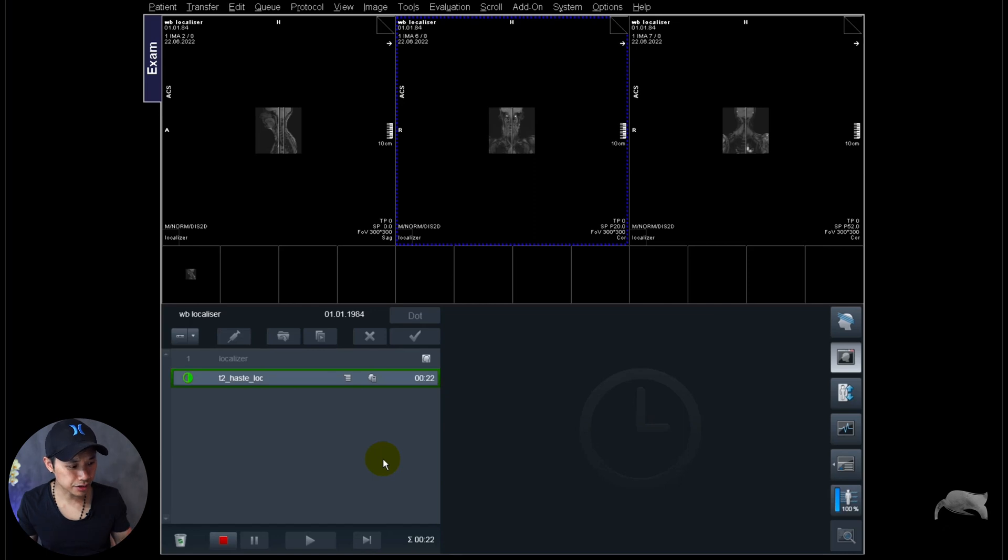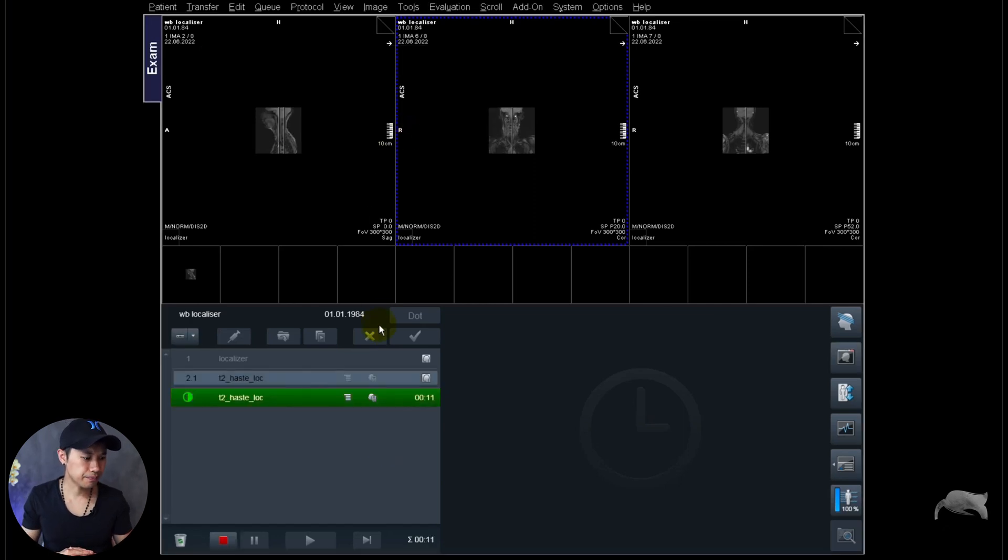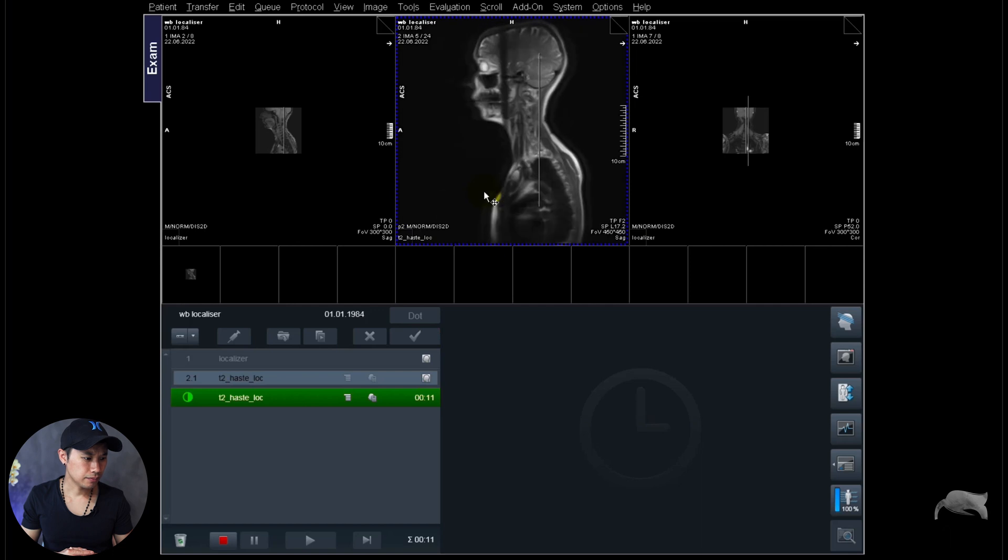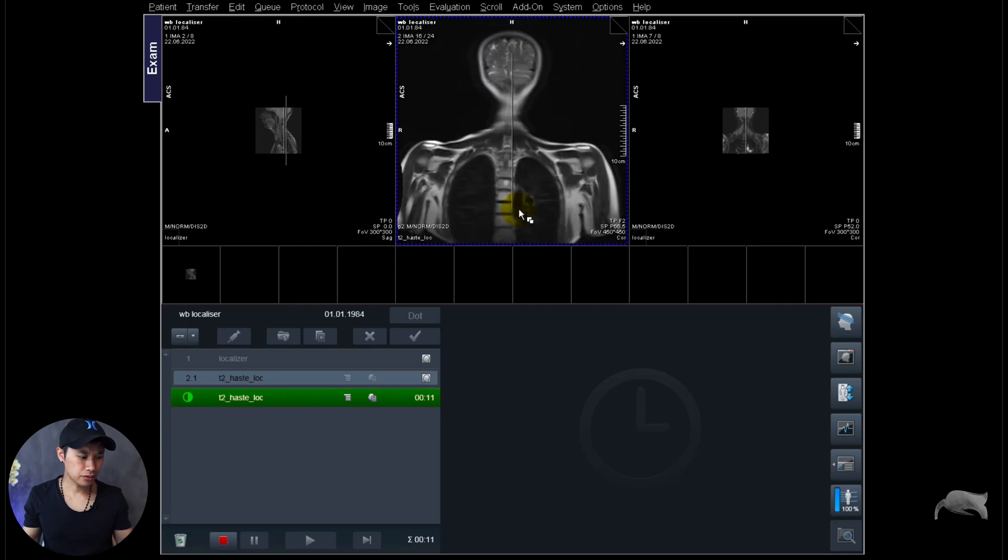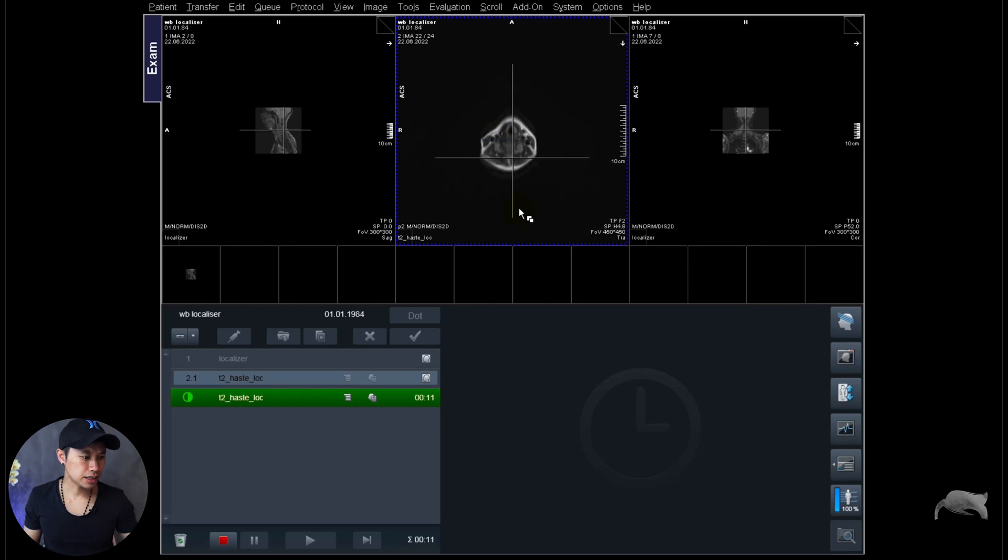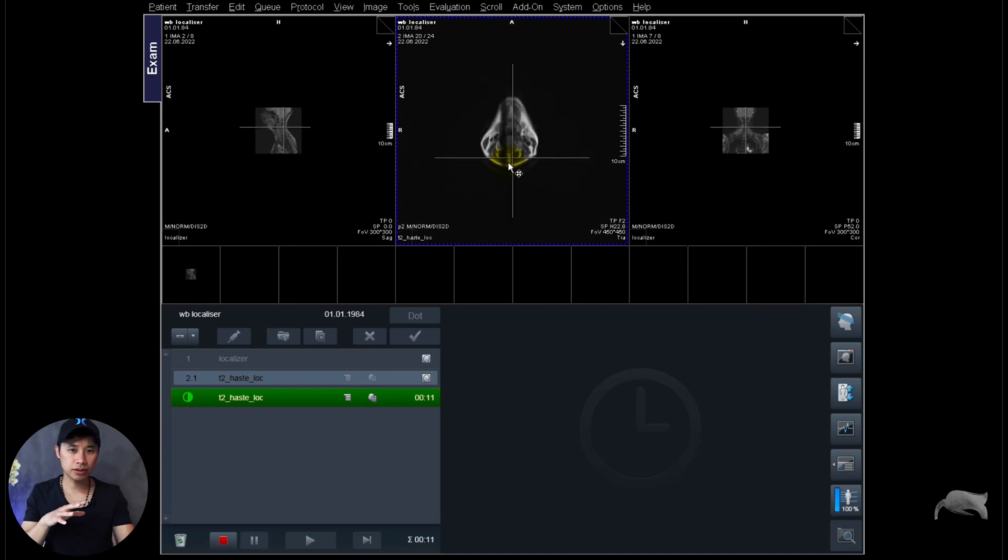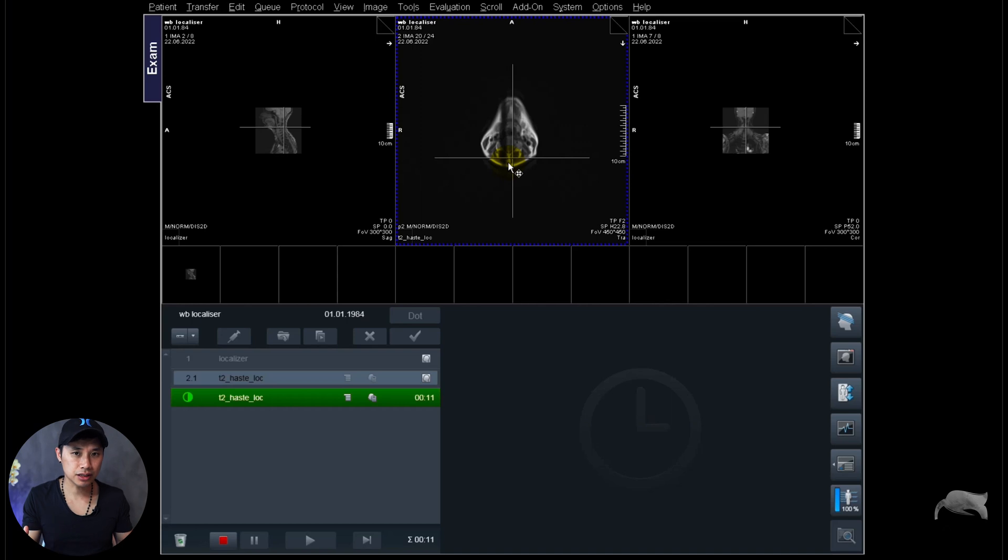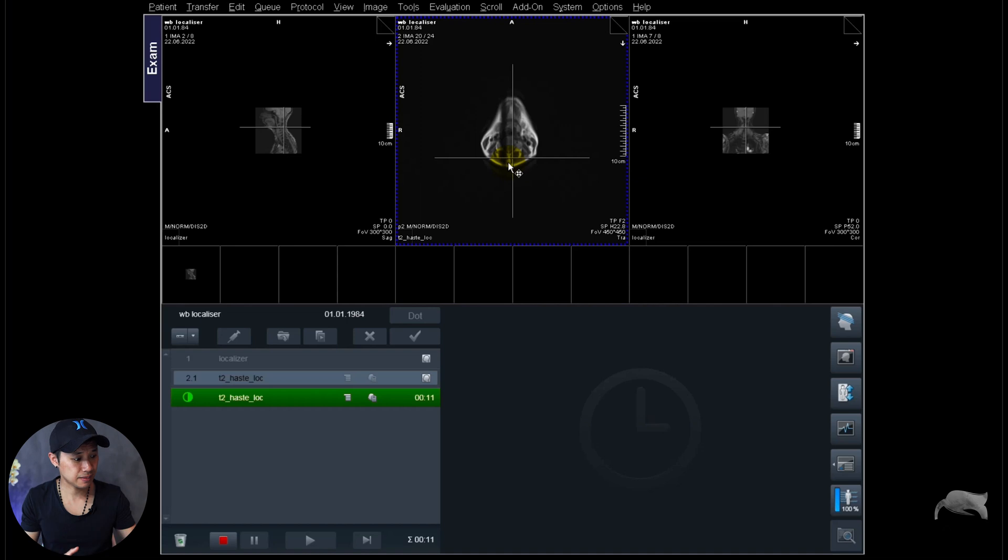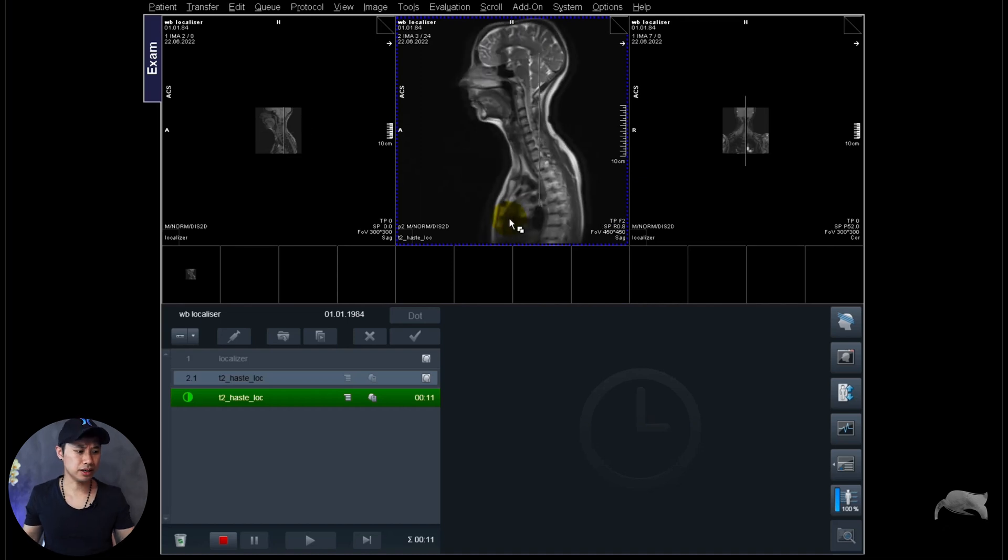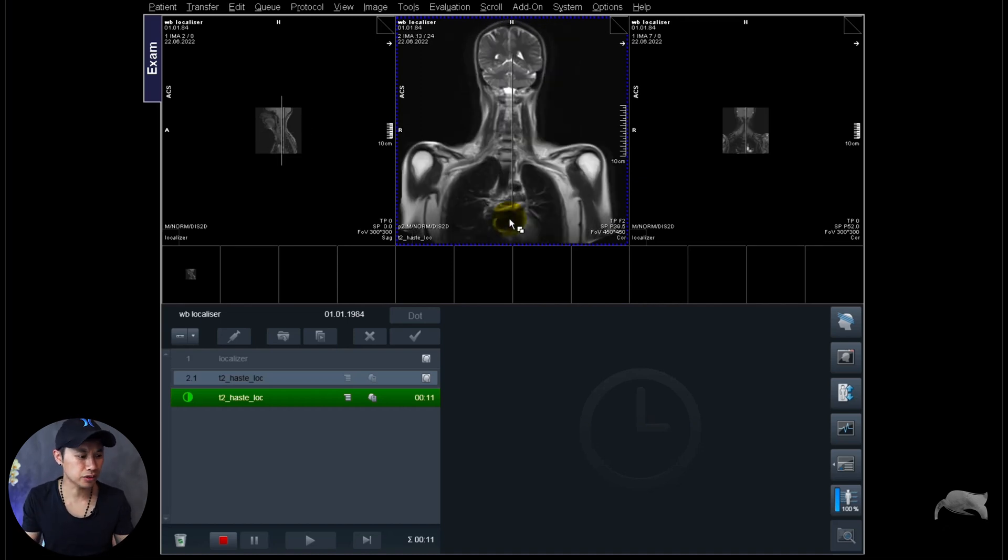So no SAR issues and it's running. First step is finished now. It's nice, great overview, it's fast and it gives exactly what I need. And you can see, let's stop there. The black line right there is because we get a cross excitation, cross talk, you know, it's because the TR is so low so the excitation pulse is extremely fast.